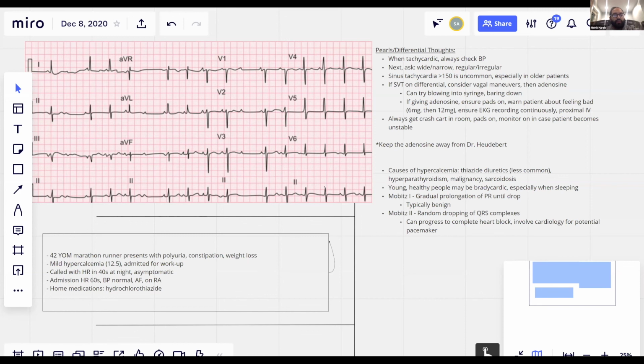So for the first case where it was an SVT event, if that patient's on tele and you weren't sure based on the EKG whether it was true sinus tach versus SVT, if you looked at the tele and you saw a gradual increase over time to that 150, that might lead you closer to this being a sinus tachycardia developing and something else causing it.